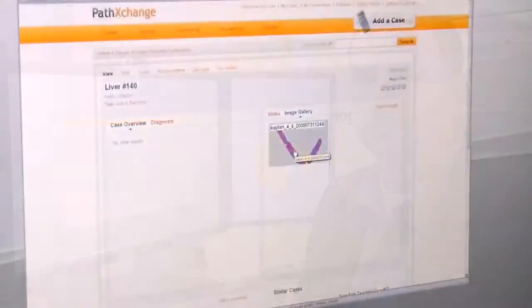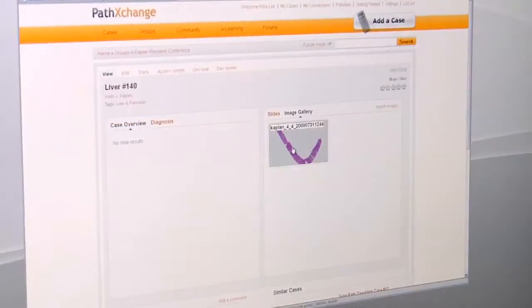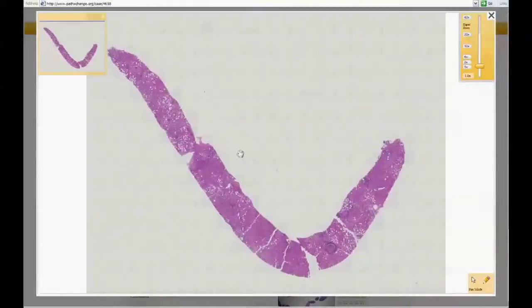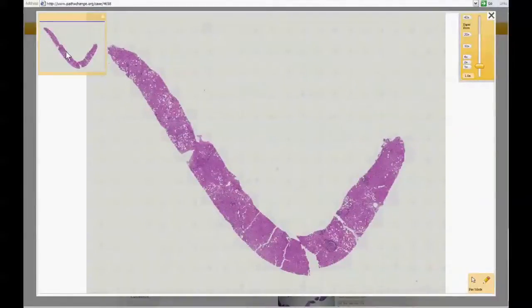I'm going to go ahead and log into a liver biopsy case that I've had scanned in and show you that case and my approach to liver diagnosis. Using Path Exchange, I'll go ahead and click my mouse to open up this case for viewing. Once the case is launched, you can see a low power overview of the entire slide to ensure that you have the entire slide scanned and are looking at all the tissue represented on that slide.